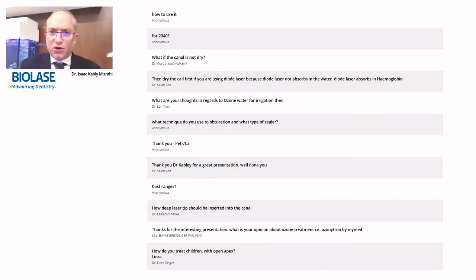Okay, so let me go with the questions you asked in the box. Well, what if the canal is not dry? I will strongly recommend to use the erbium chromium YSGG with the canal filled with water always, in order to work for that ablation of the smear layer that I was talking about. As my dear colleague Dr. Salearia just stated here, if you are going to use a diode laser, then you first can dry the canal since it's not absorbing water, and then you can go ahead and disinfect and complete the disinfection with the 940 nanometer laser.